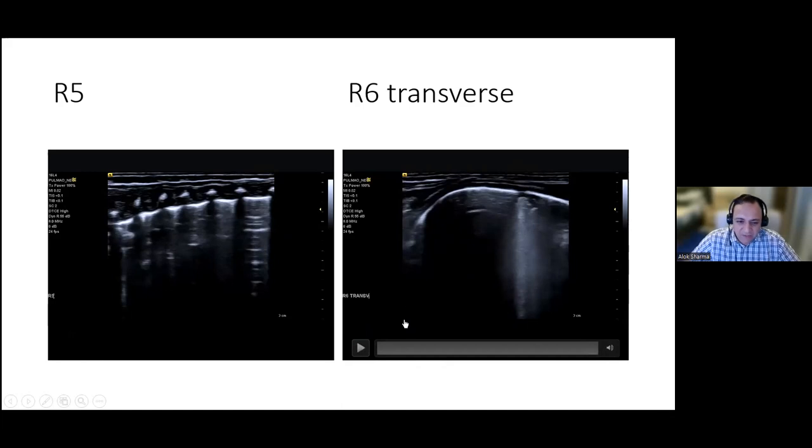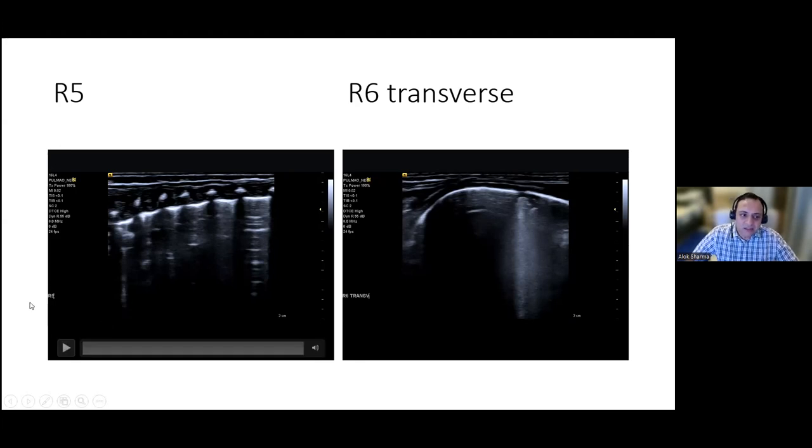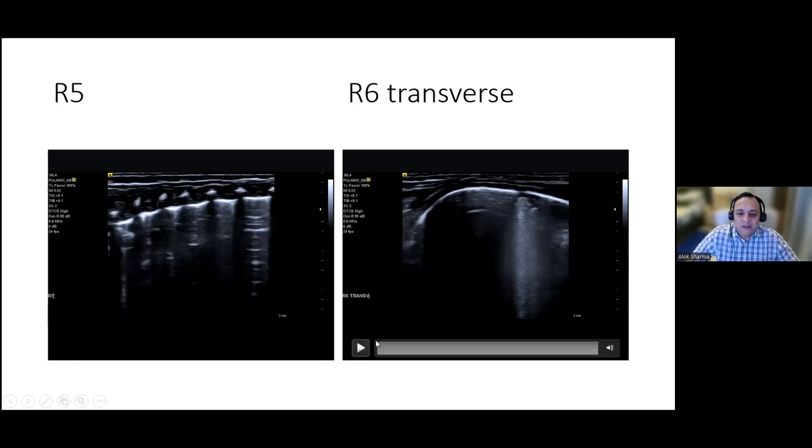And everybody asks me what a deep consolidation is. Can you see in the transverse view how you can trace it all the way down to 3 centimeters? People sometimes get confused and talk about deeper areas which are patchy on the scan, but which do not originate from the pleura. Unless it originates from the pleura, you can't call it a deep consolidation. Theoretically, that doesn't mean there's no consolidation, it might just be that the angle of the view doesn't meet the pleura. But this is a very nice example of a consolidation that extends quite deep into the lung.